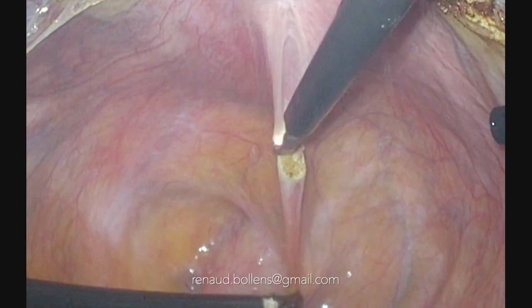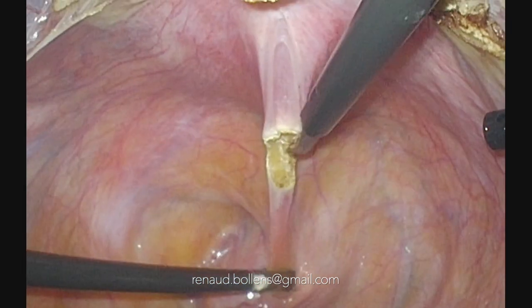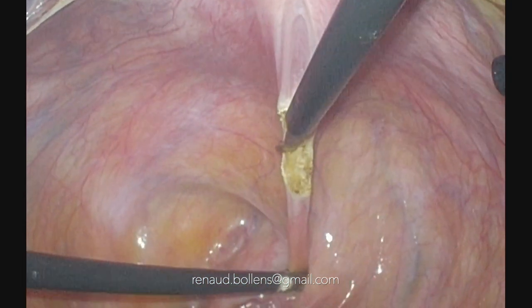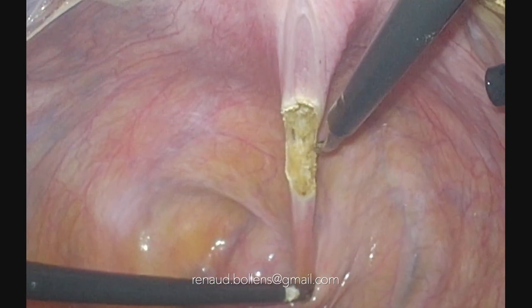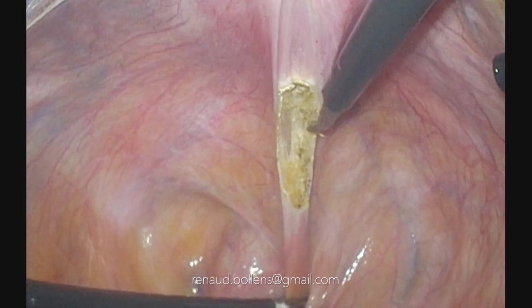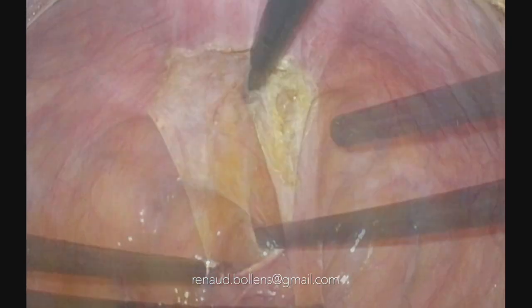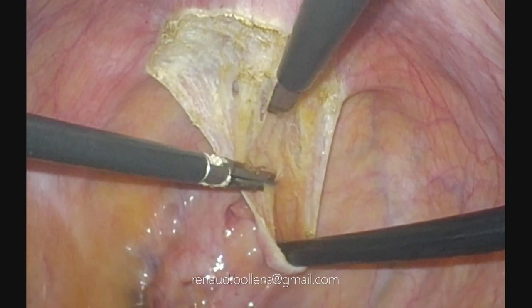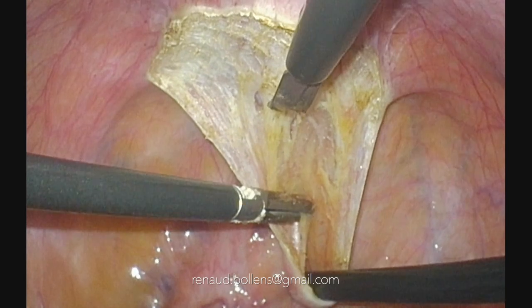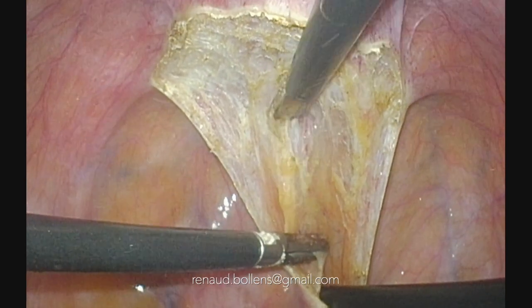You can see small surface of contact for the coagulation, tension on the tissue, and I increase my tension step by step with my hand, and small surface of contact, okay? This is a basic technique when you use just one direction of traction. I open a little bit my scissors to have like a micro spatula, a monopolar coagulation, and I push, okay?